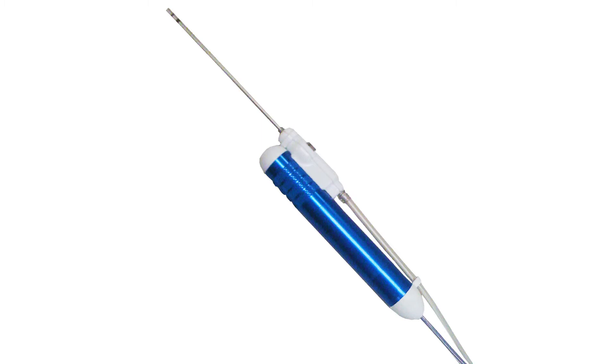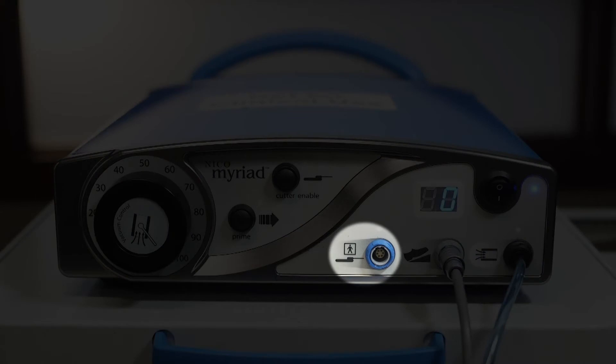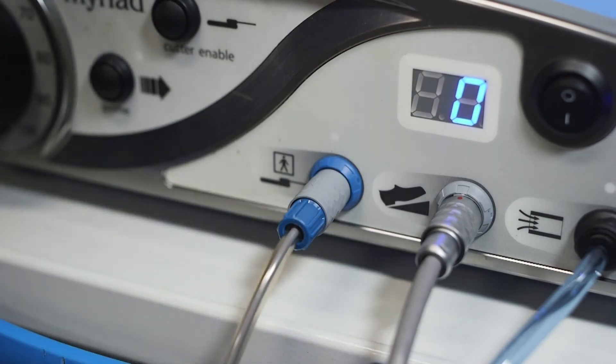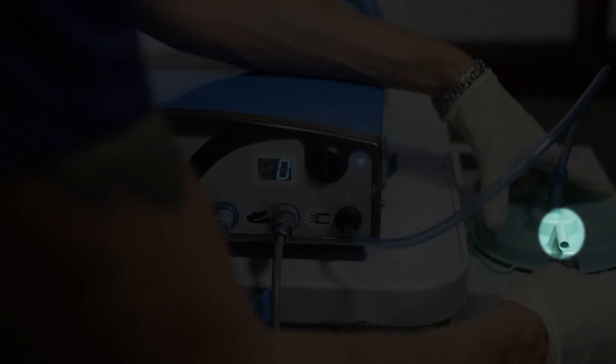To connect the handpiece to the console, pass the handpiece connectors into the non-sterile field for connection to the blue receptacle on the console until it clicks into position. Connect the suction line into the front of the waste canister.